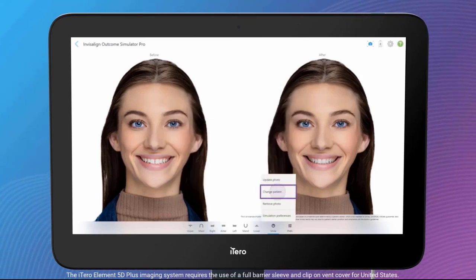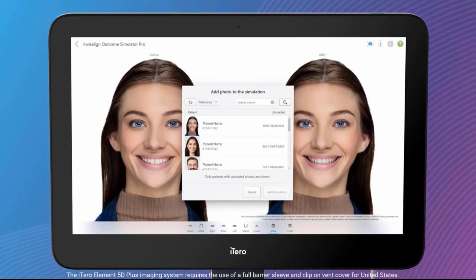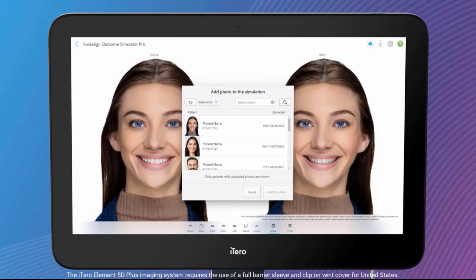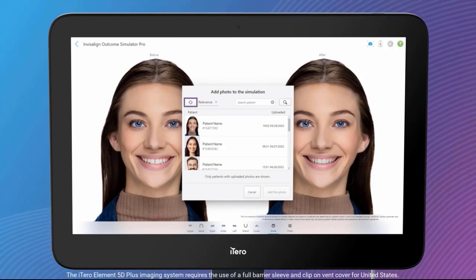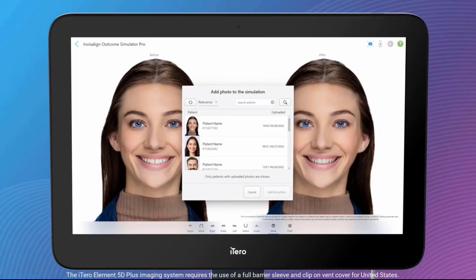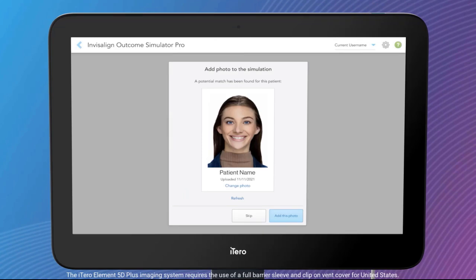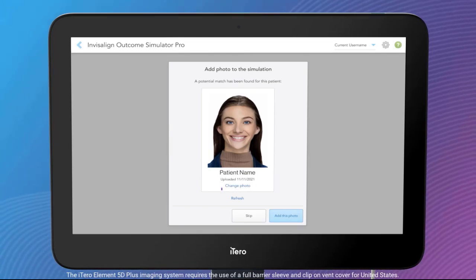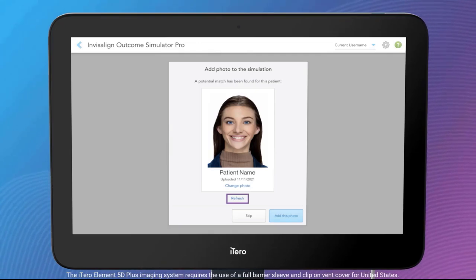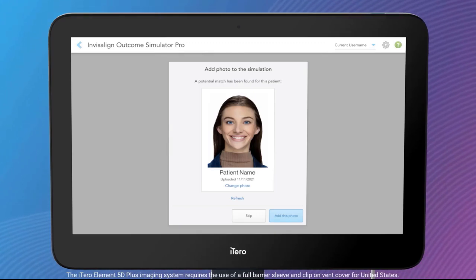The patient can be changed by tapping on Change Patient. You can search for a patient on the patient list. Tap on Refresh if the patient's photo doesn't appear. Select the correct patient photo from the patient list and confirm that the photo matches the patient by tapping the Add This Photo button. The patient's photo can also be changed before adding it to the simulation. If the patient's picture is not a correct match, tap on Change Photo. If you don't have the patient's wide smile photo, you can still use Invisalign Outcome Simulator Pro 3D Model View.